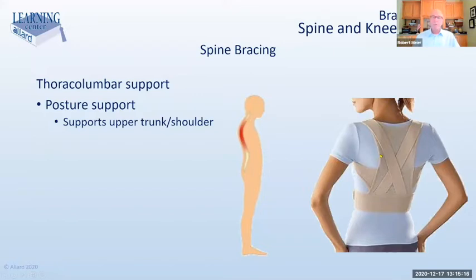The problem that a lot of people run into with a brace like this is that they think, oh, that curve isn't bad enough. Yeah, I'm having some pain back there in my back, but it's not real bad. I really don't want to wear a brace. No one goes through adolescence saying, gee, when I get to be an adult, I really want to wear a brace. So that's nobody's goal. But they can offer so much help and support, and they can make a person's life so much easier just by offering that little bit of support.